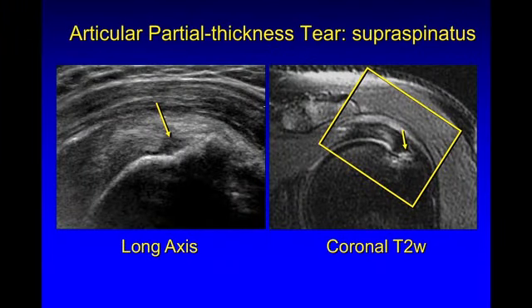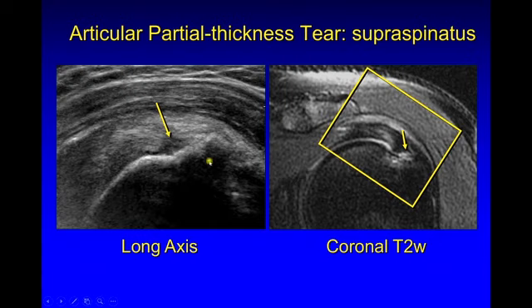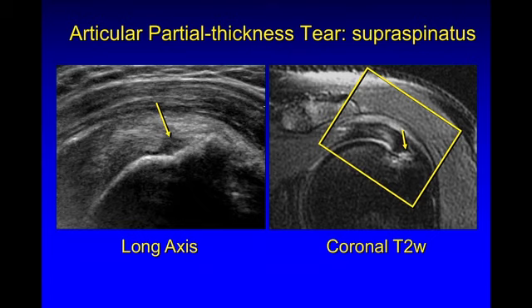Here's an example of an articular-sided partial thickness tear of the supraspinatus. We have a well-defined defect touching the hyaline cartilage over the humeral head. It's not touching the bursal surface, therefore excluding a full thickness tear. Note that the MRI is essentially a mirror image of the ultrasound — normal tendon on ultrasound is bright, while on MRI the normal tendon is dark. The abnormality or tear is dark on ultrasound and bright on MRI. The bone cortex is bright on ultrasound and dark on MRI — same anatomy, although higher resolution with the ultrasound.